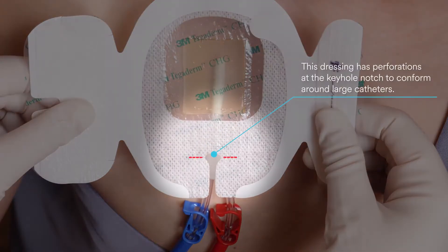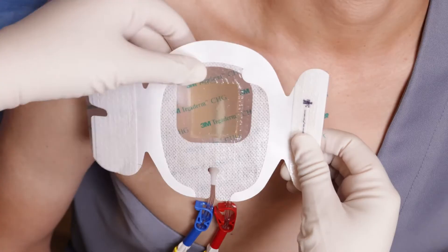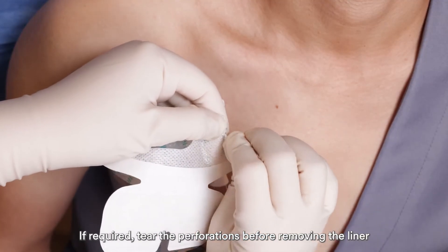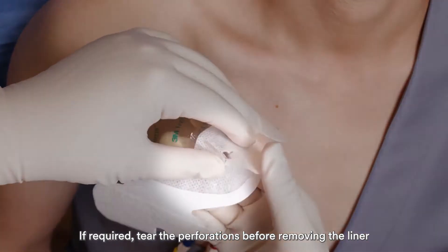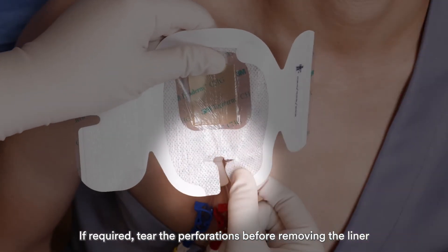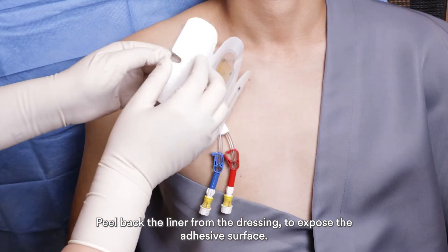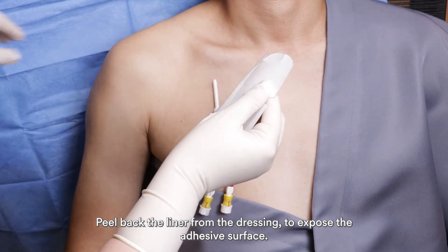This dressing has perforations at the keyhole notch to conform around large catheters. If required, tear the perforations before removing the liner.